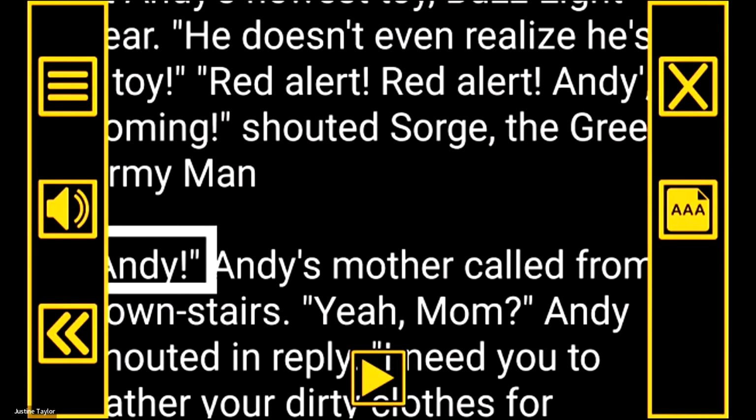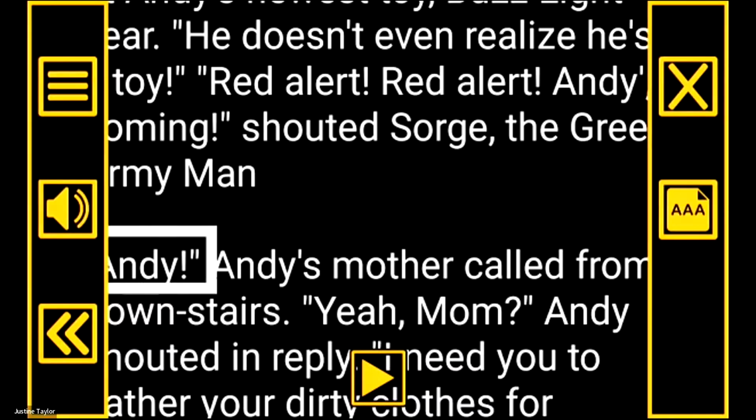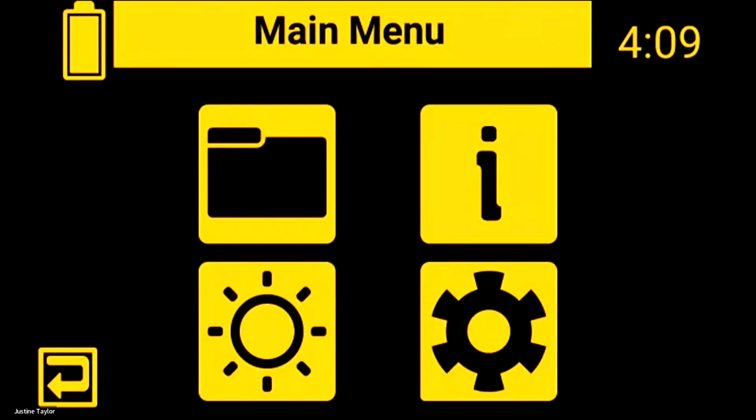I know you were mentioning that it was different. And then they wanted to see how to change the menus, to turn on the speech for the menus. Someone had asked. Okay, and then they asked something about the files. So let me get you back to your main menu here.